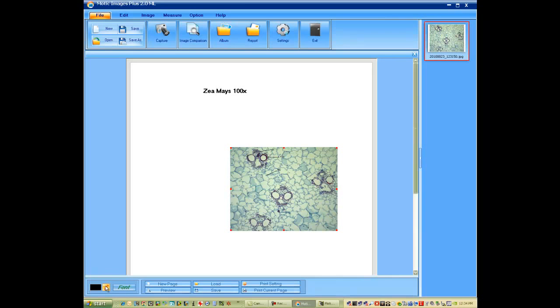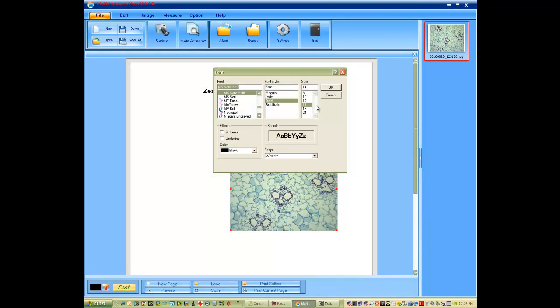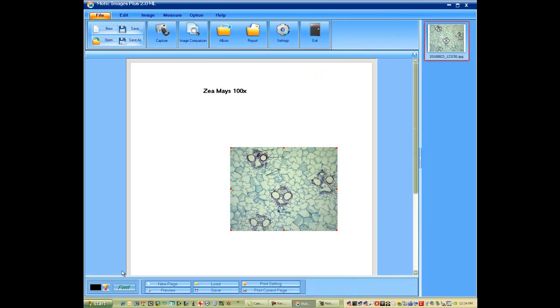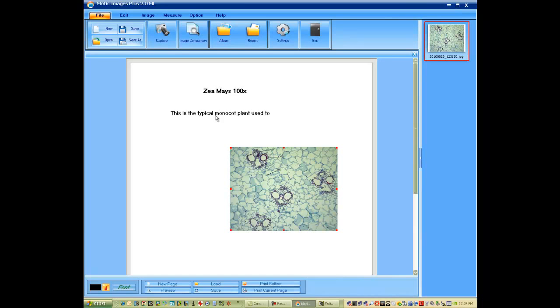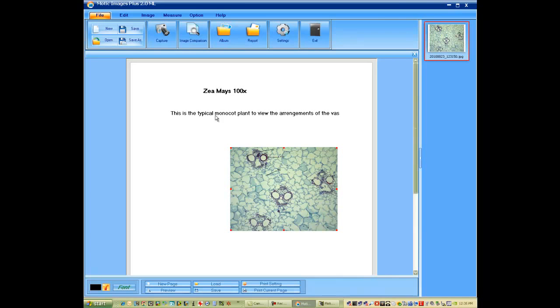And we'd like to open up another text box. Change our font back to a normal script. Say OK. Open up our text. This is the typical monocot plant used to view the arrangements of the vascular bundles.